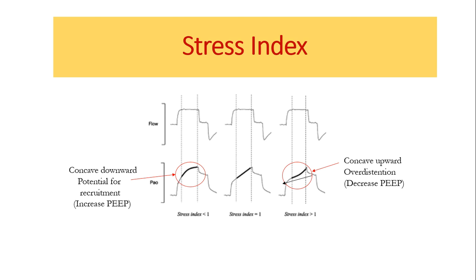Right. Let's put it in a very simple way to remember. Recruitment means swelling, it is swelling up, okay? So if it is swelling, it is recruitment. That is overdistension: the rest of the things are getting compressed, going down, getting pressed. Easy to remember.